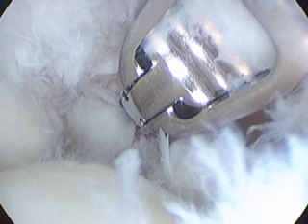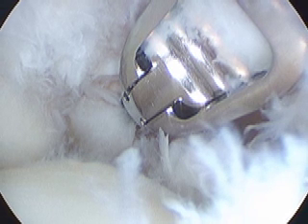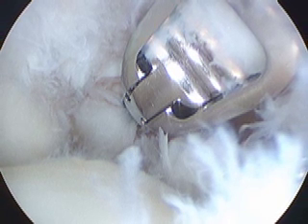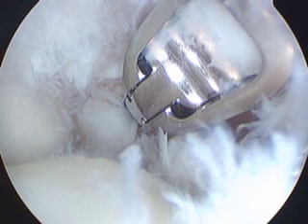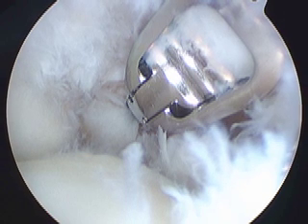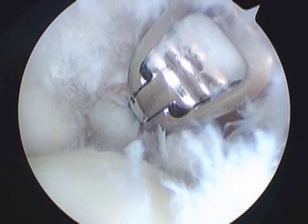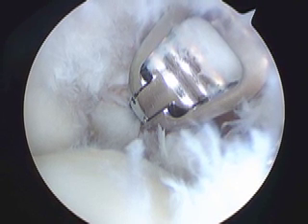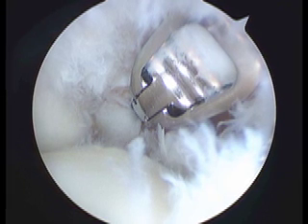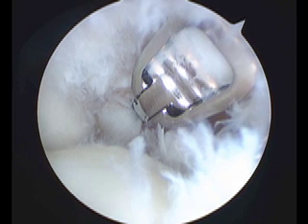Elbow stiffness is a very common problem following elbow trauma or even elbow surgery. When conservative management fails, generally after 6 months, open release has historically been indicated with various results. Much more recently, arthroscopic release has shown to be a very interesting tool to deal with such problems, and better results are being reached every time. This case is a very nice example of how useful arthroscopy can be in such cases.